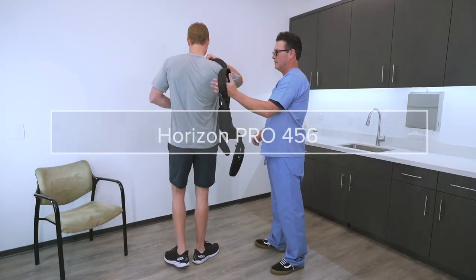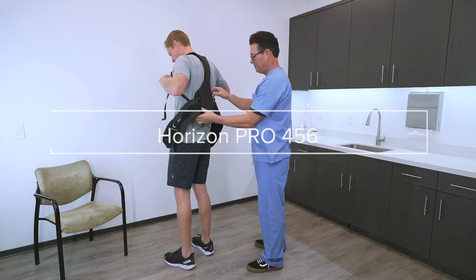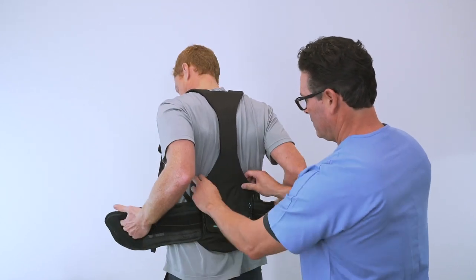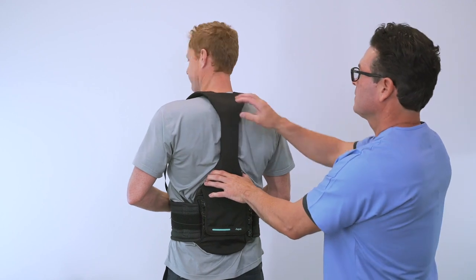The Horizon Pro 456 TLSO is easily applied like a jacket or a backpack. Start by positioning the belt as shown previously. It is not necessary to tighten with the pull tabs at this time.